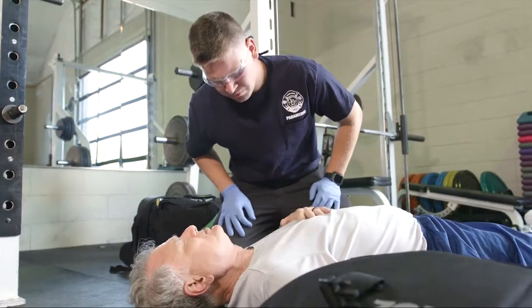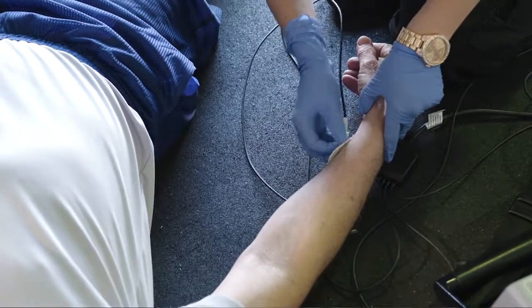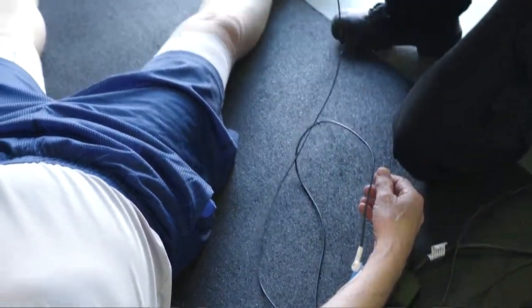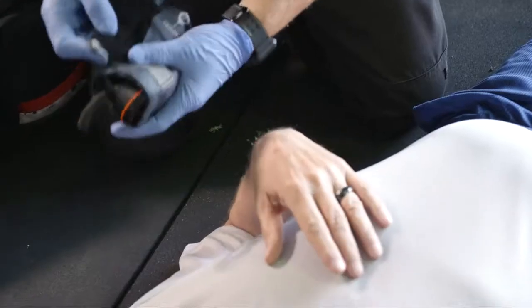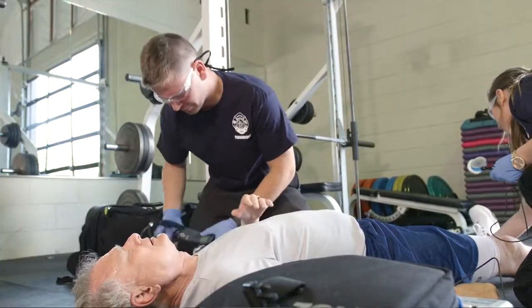From a field perspective, while it's possible to suspect a heart attack without a 12-lead ECG, and you can do that based on the clinical presentation, just because you suspect a heart attack, you have no idea whether or not this is a STEMI or a non-STEMI. And the only way to make that decision is with the 12-lead ECG.